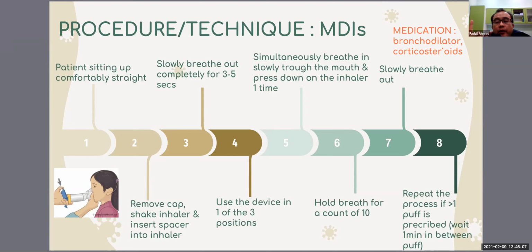After that you breathe in 5 times, finish. No need to hold the breath at all. Okay. In the exam you will get zero marks. Okay, doctor, so no need for the breath, just use the MDI. If pressing without a spacer, breathe in.